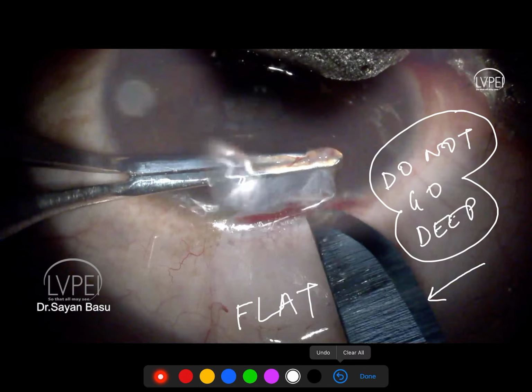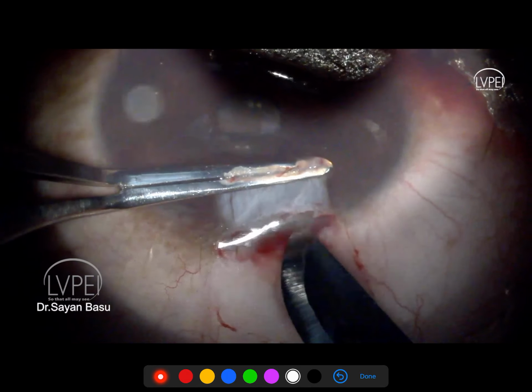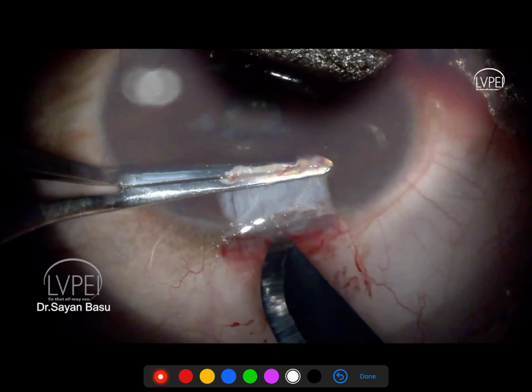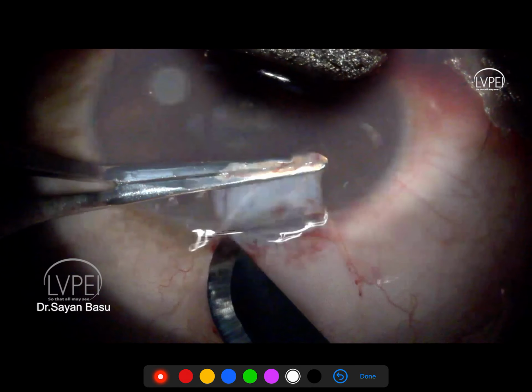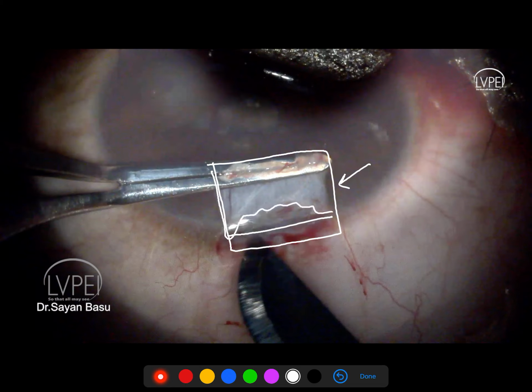Now this is critical. Now I continue my dissection, and now I am dissecting into the grey clear cornea, and this is basically, now that I have dissected enough. So if you see the anatomy of this tissue, now focus very clearly into this part of the dissection here. This is the stromal area that I have dissected, and if you look here at the reflected conjunctival flap, you will see that there is this area which has this whitish discoloration. This is the conjunctiva.